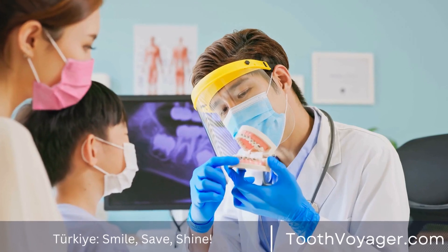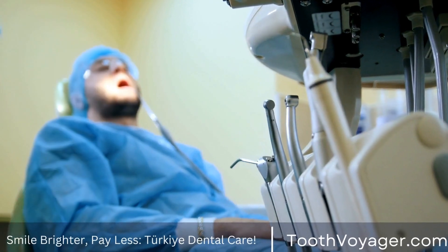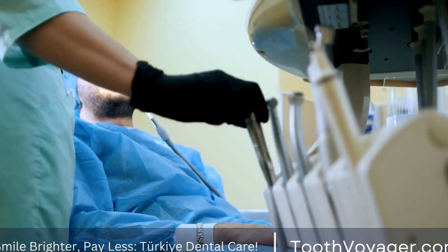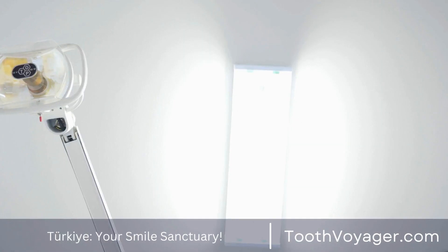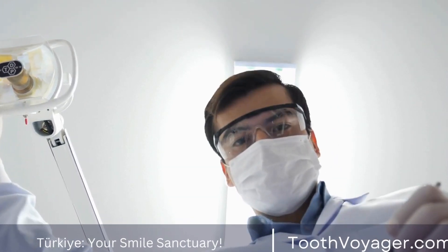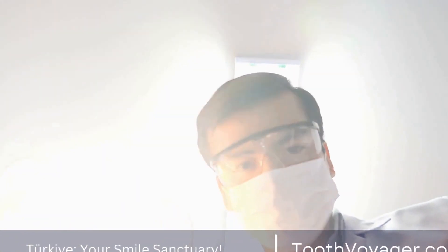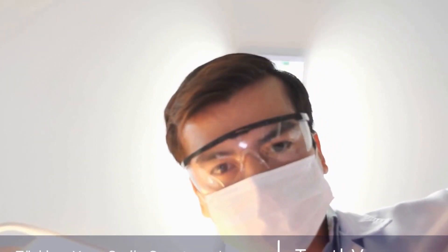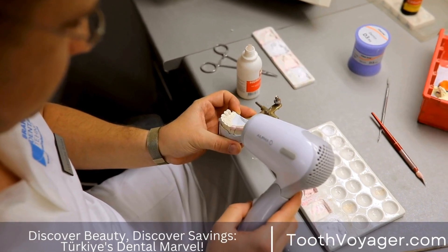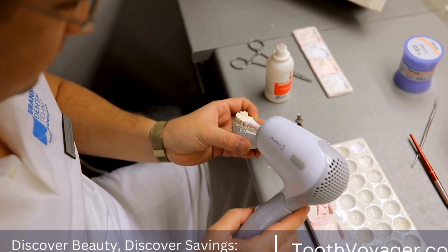Preparation and Design: After the material has been chosen, the dentist will prepare the teeth for the veneers. This process involves removing a small amount of enamel from the front surface of the tooth to make room for the veneer. The dentist will then take another set of impressions to create a mold of the teeth.